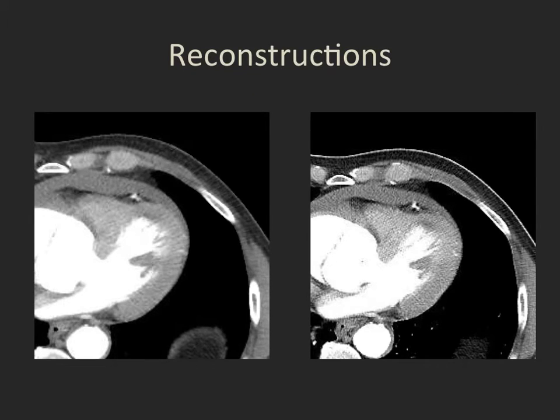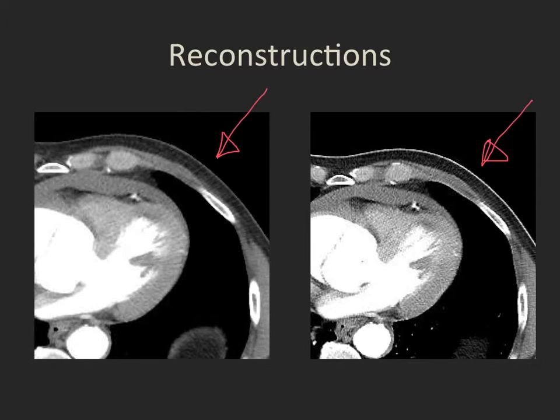This is the same set of data from the same patient, looking lower in the thorax at the heart. On the left is the smoother soft tissue reconstruction. On the right is the same data displayed with a lung reconstruction — much grainier, crisper, and more contrasty for soft tissue structures, which is less pleasing for interpretation. So we look at soft tissues on a soft tissue reconstruction and the lung on the lung reconstruction.